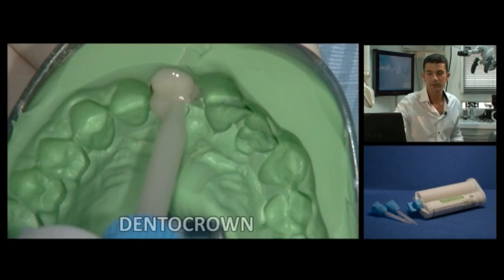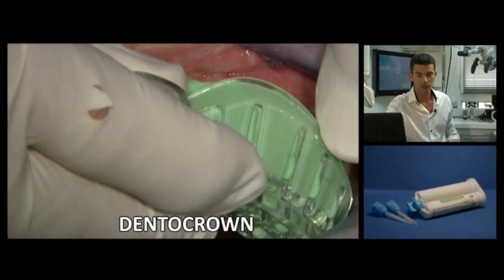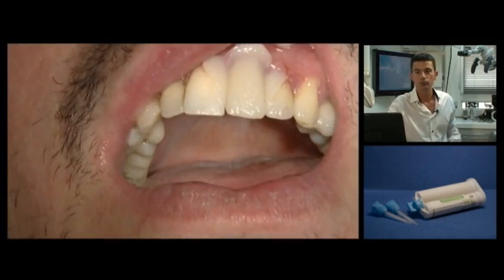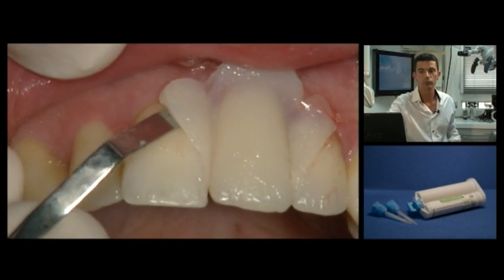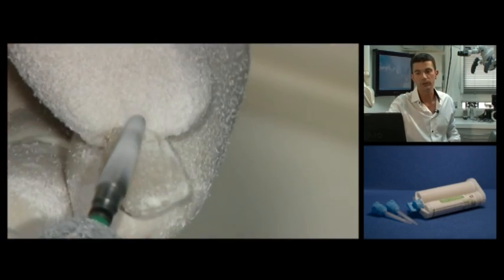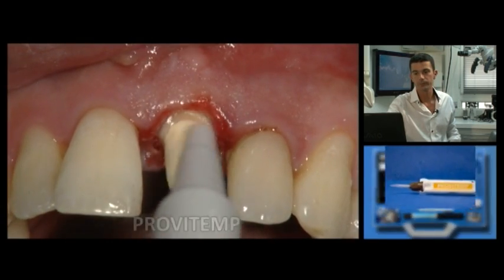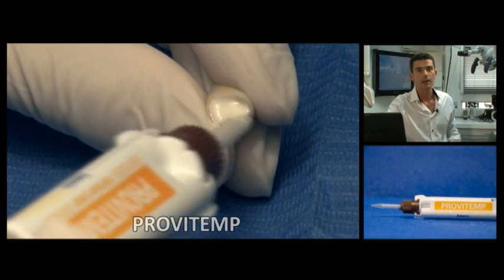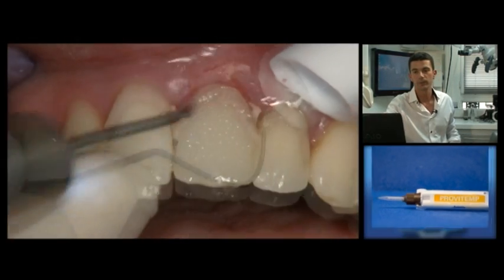A temporary resin is injected into the initial impression so as to make a temporary tooth for the new clinical situation by duplication. Excess resin is flexible and easily broken so that this new temporary tooth can be easily withdrawn. It is finished and then polished, given a final check, and temporarily sealed. This temporary material sets relatively quickly and any excess is easy to remove.